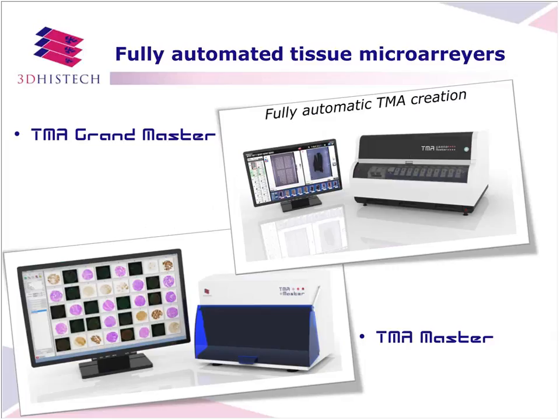Our company produces fully automated tissue microarrayers. Our flagship TMA product is the TMA Grandmaster. We also have a smaller machine called TMA Master. The TMA Grandmaster is a high-throughput machine, has 72 block capacity.